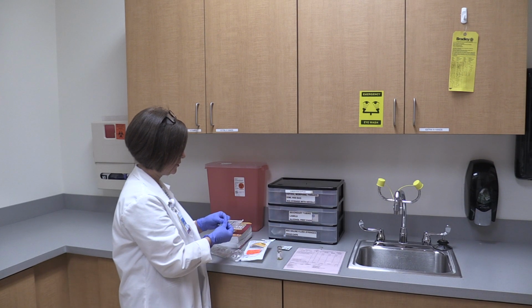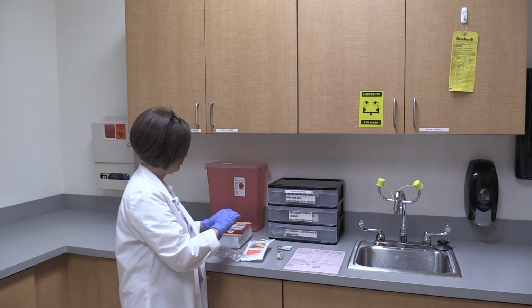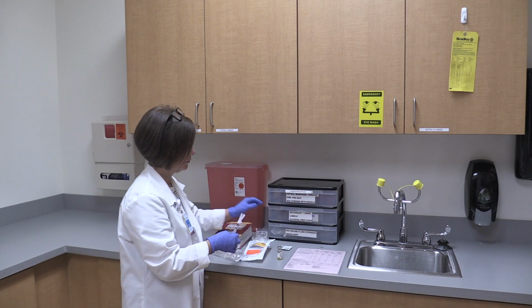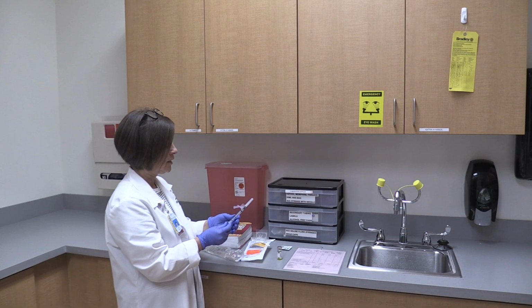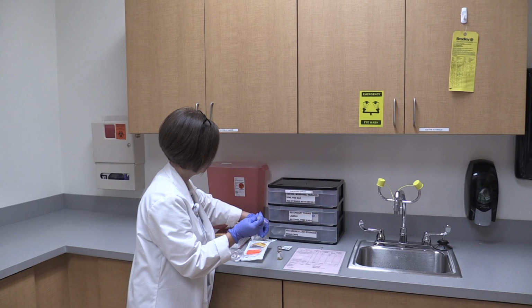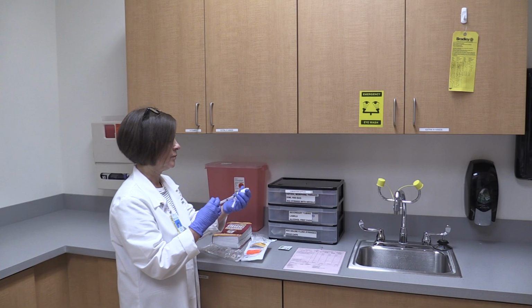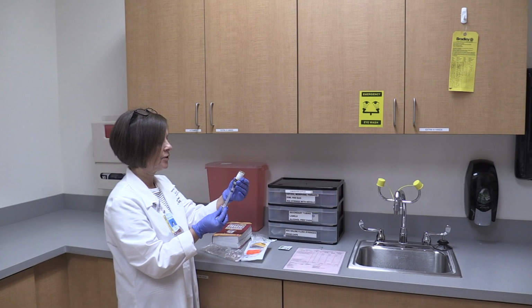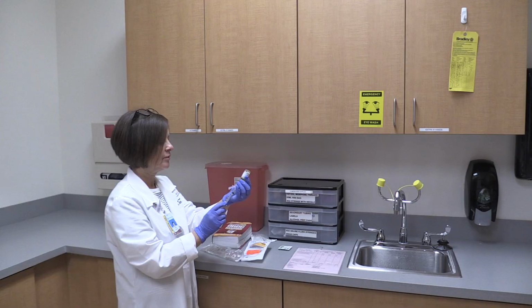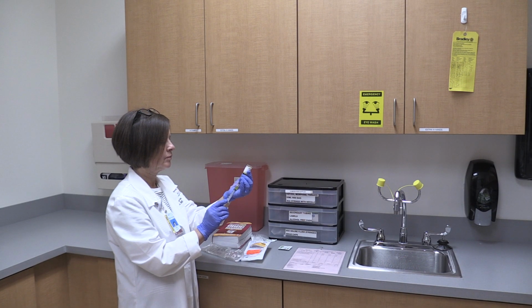Take my syringe. And I need 1 ml, so I'm going to pull back for 1 ml of air. Insert the air and draw back the 1 ml of medication. I'm going to make sure that I don't have any air bubbles.